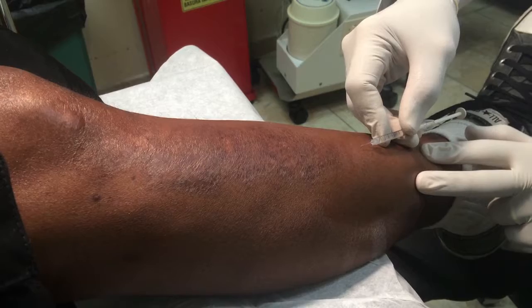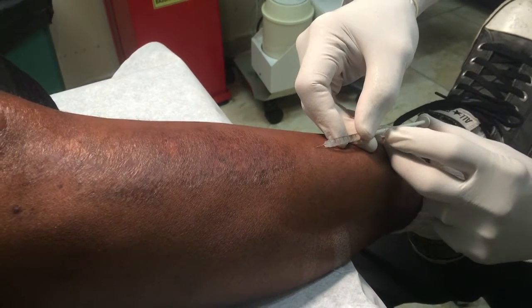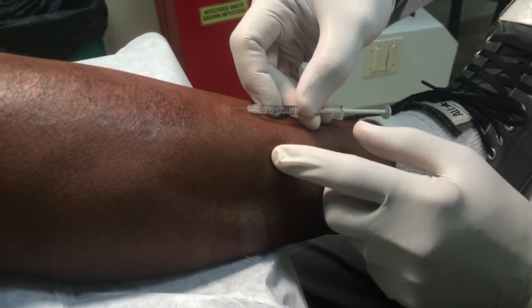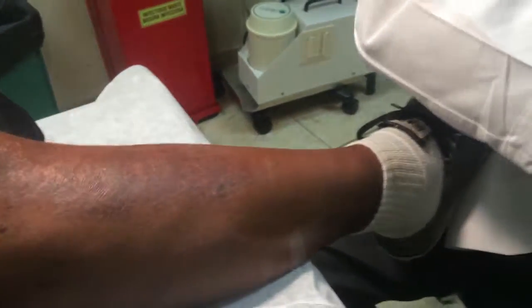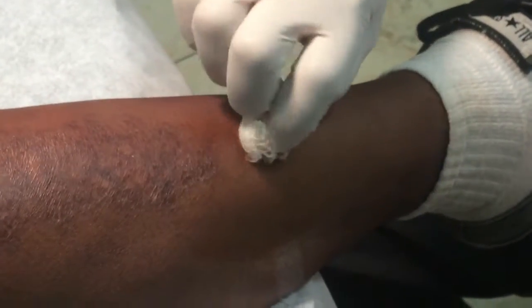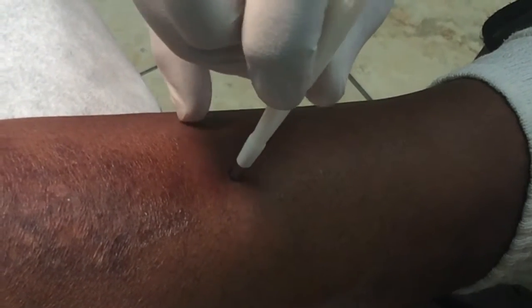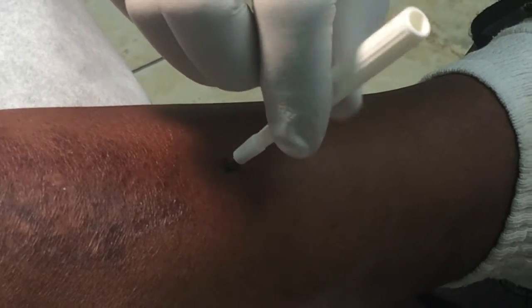Go at 15 to 30 degrees with the bevel up. The patient did not move so we know that it's not that painful. Make a small bleb — see, it is coming up, it is a raised area, a wheal or a bleb. Now take it out and clean it again with a swab, then use your punch biopsy forcep perpendicular to the skin and make a circular movement until you feel no resistance. Once you feel no resistance, you know that you have taken the part of the dermis as well.